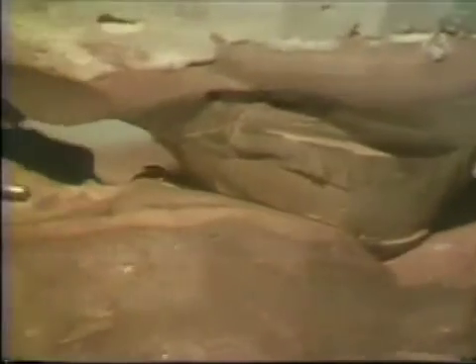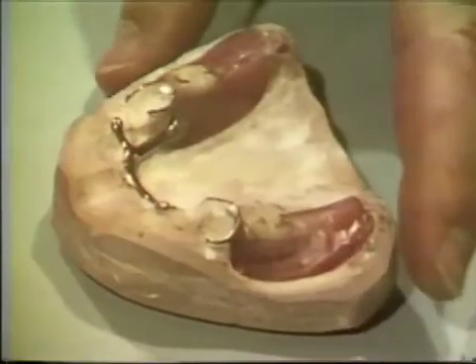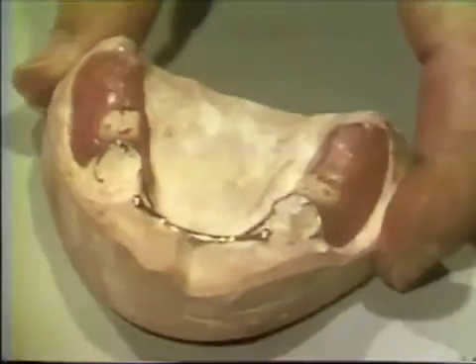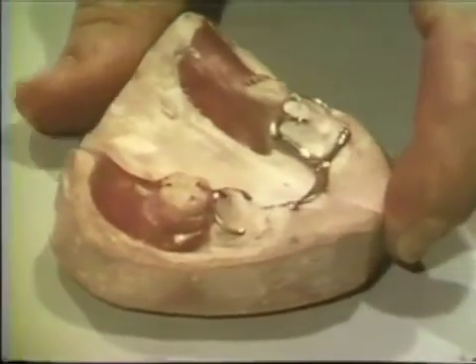When the replacement teeth are set and the mounting has been inspected to assure that all occlusal stops are closed, the curing cast may be removed from the articulator. The intermediary steps of try-in or occlusal check bites, which are a part of some procedures, are dispensed with when the occlusal pathways are recorded dynamically. The base contours are now waxed preliminary to processing.